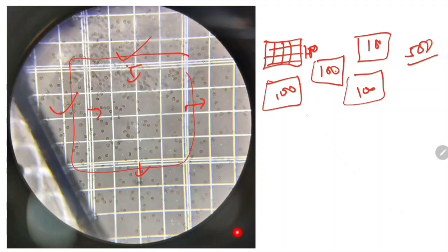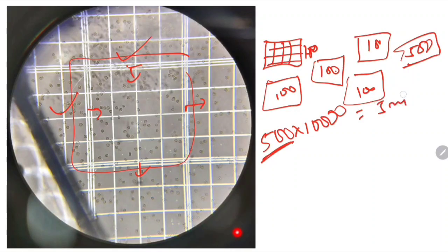Why should we fix it with the formula? Because the final number is 500, then suppose 500 is the final number, so 500 into 10,000. So you get 5 million. If you are counting one extra cell, so if you get 501, then your counting will be 10,000 extra cells. And if you are counting one cell less or 10 cells less, then each and every cell will reflect in the final number as a 10,000 decreased or increased number. So that's why we should be very, very careful while counting, and carefully we should consider the triple line.